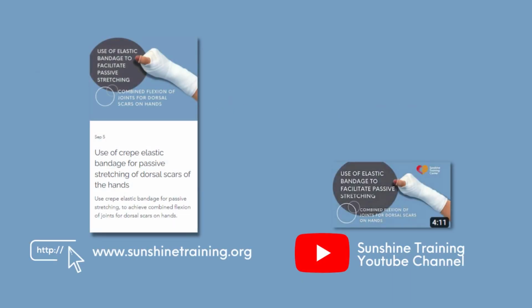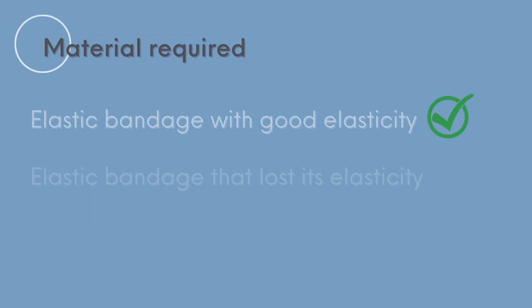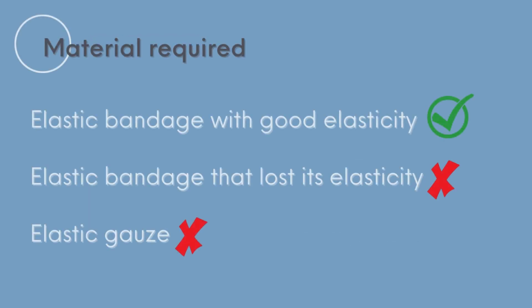This video is a continuation of a previous blog post and video in which we talked about the principle behind the use of crepe elastic bandage for passive stretching, how it can be used to achieve combined stretch of multiple finger joints, as well as relevant precautions. You can check out this previous blog post on Sunshine Training website, as well as watch the previous demonstration video on our YouTube channel. As a reminder, be sure to use elastic bandage with good elasticity.